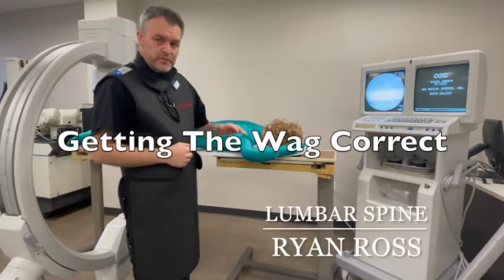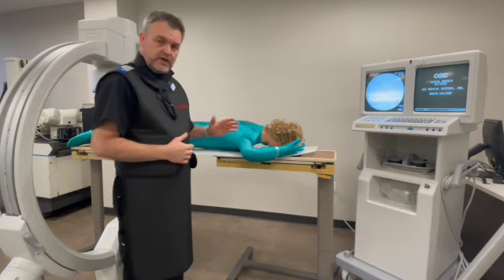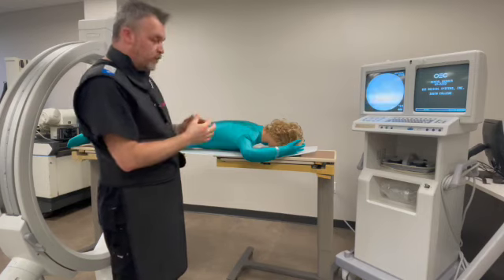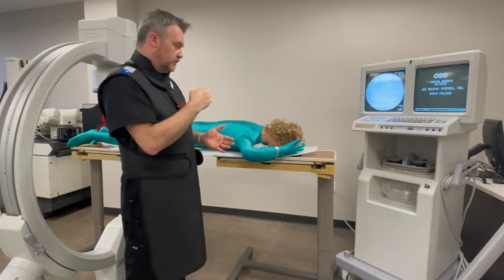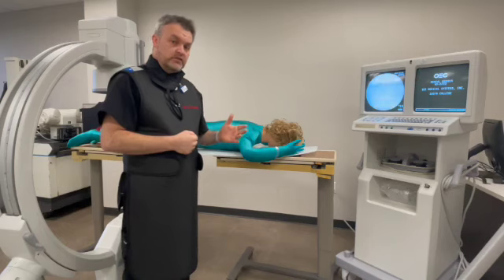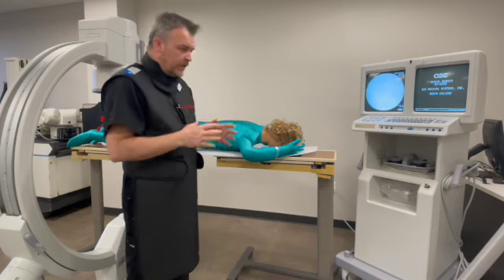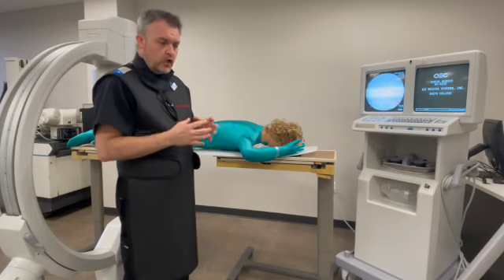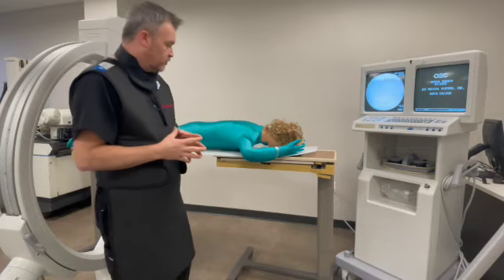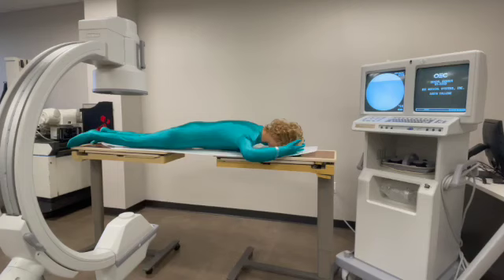In the last video we showed how we can best guess for our lateral height. What happens if we come in and we don't have a perfectly lined up lateral? Is there a way we can best guess to get that perfect lateral? If we're not able to view the preoperative images to see if there's any scoliosis or anything going on with the patient, that could be a contributing factor. Hopefully we get a chance to see those, but it's not always possible depending on your facility's volume. I'll demonstrate a non-perfect lateral first.